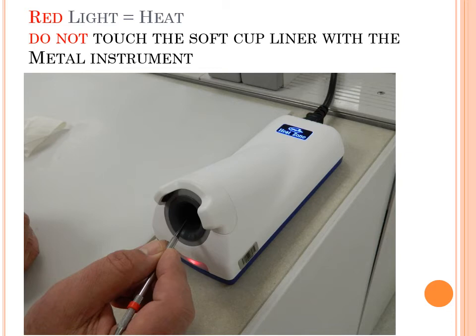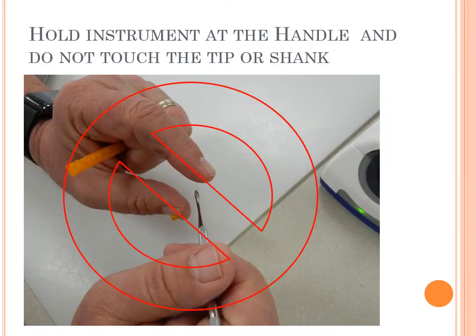While it is heating your metal instrument, please do not touch the metal instrument to the soft cup liner inside, because that will start to melt. Make sure you are holding the instrument at the handle and you do not touch the tip or the shank, especially if you've just taken it out of the induction heater. When I say tip and shank, I'm referring to these parts with this as a tip and this as a shank. So those will be the hottest parts of your instrument.